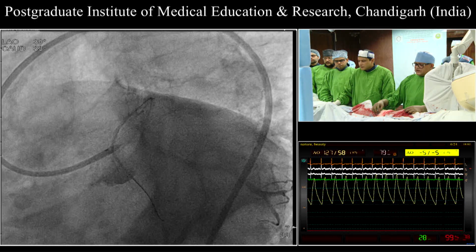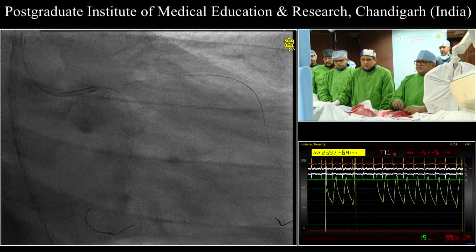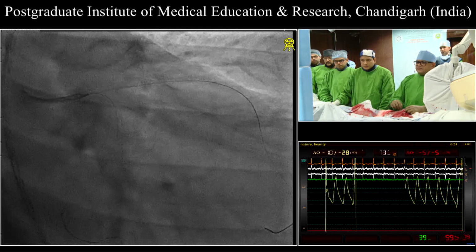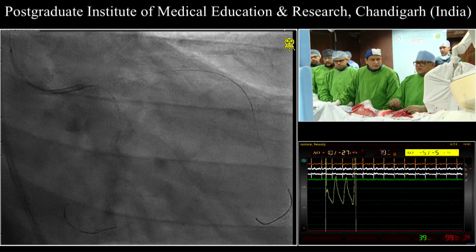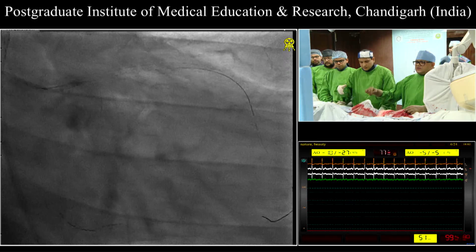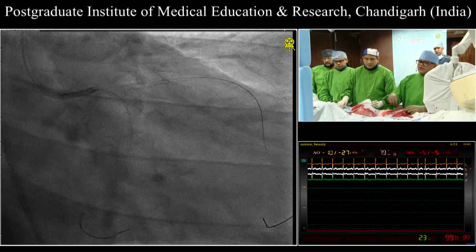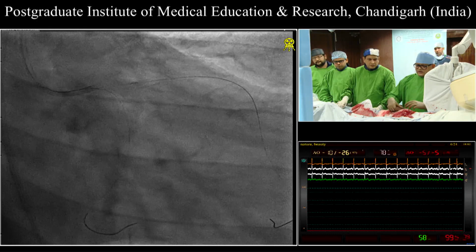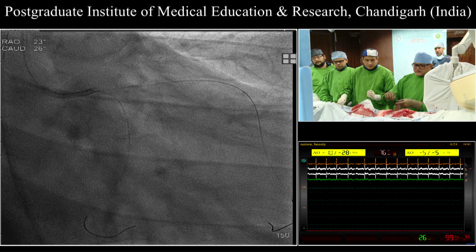Is it okay? Or do you want me to put a 3.5 millimeter? I feel a 3 millimeter is sufficient across the left main. Personally, I would use 3.5 at low nominal pressure and then post-dilate. The 3.5 platform is easier to expand. Fine. And do you want me to cover the whole LAD stent, because distally, though it's insignificant, there is a restenosis as well.